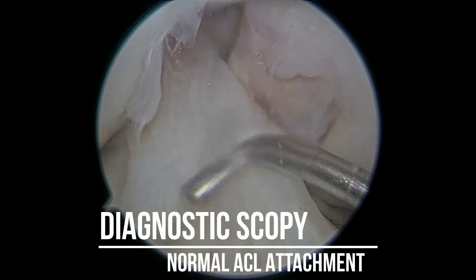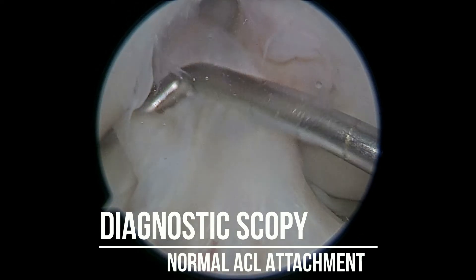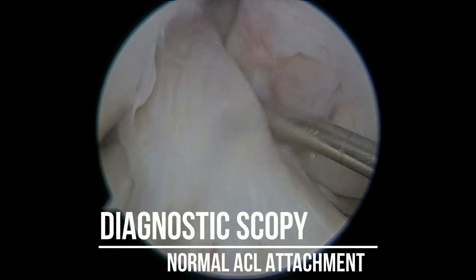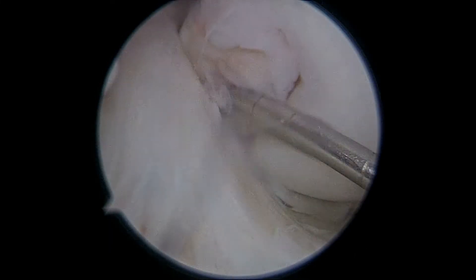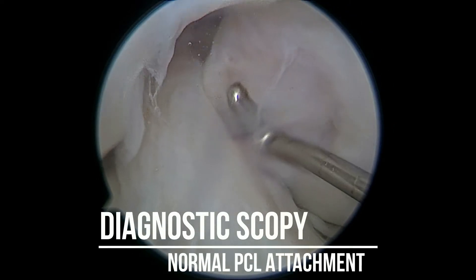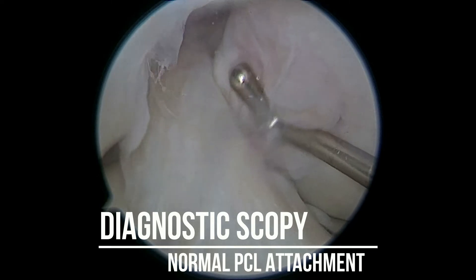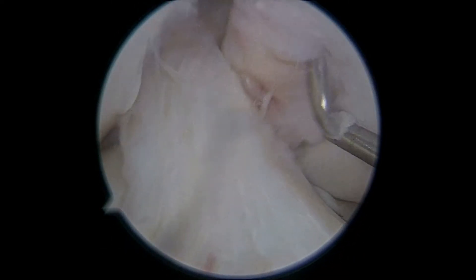Diagnostic arthroscopy also involves showing and demonstration of a normal ACL — the ligament on the anterior surface — and checking its patency. The second structure we observe is a normal PCL. The normal PCL is attached on the medial femoral condyle, and the ACL is attached on the lateral femoral condyle with its tibial root.